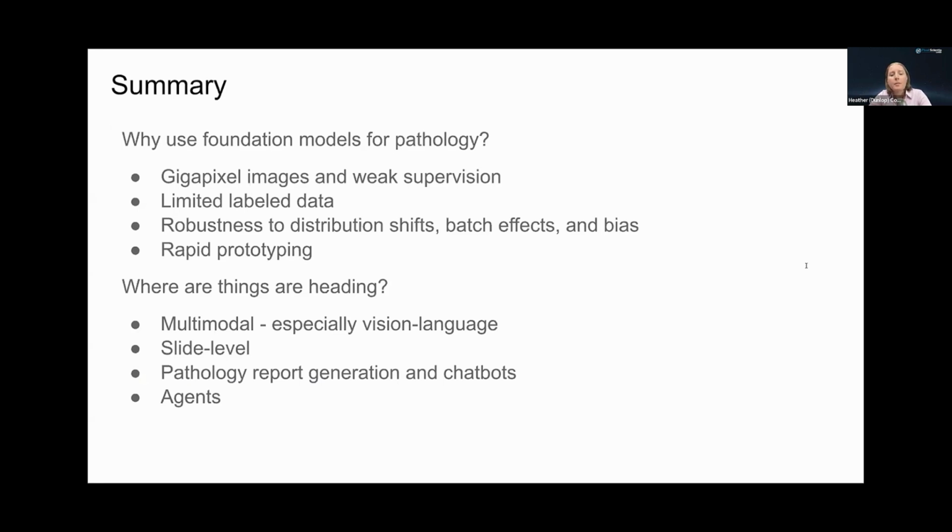There are also now models that generate pathology reports and chatbots that you can use to interact with your slides and pose questions and get answers. And we're heading more and more in the direction of agents that clinicians will be able to interact with.